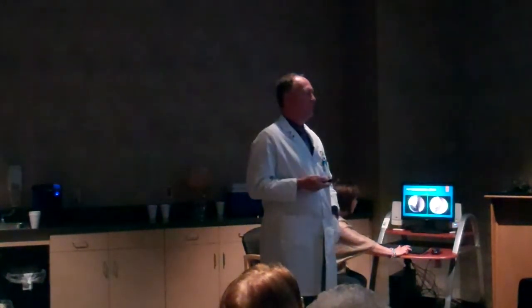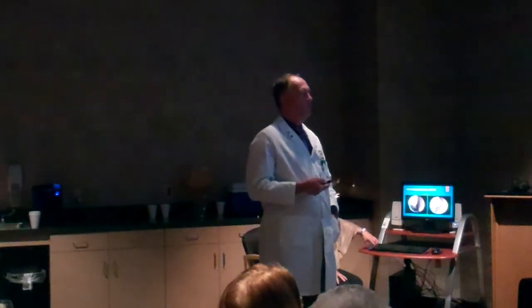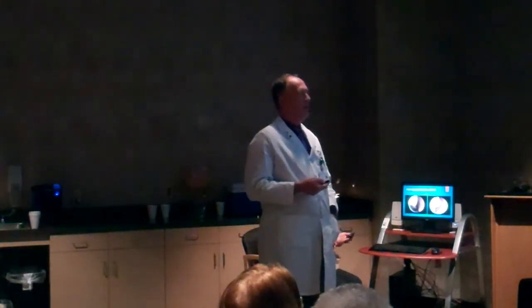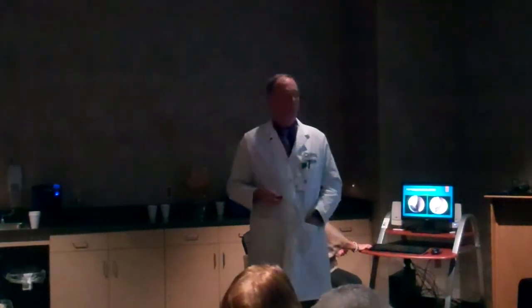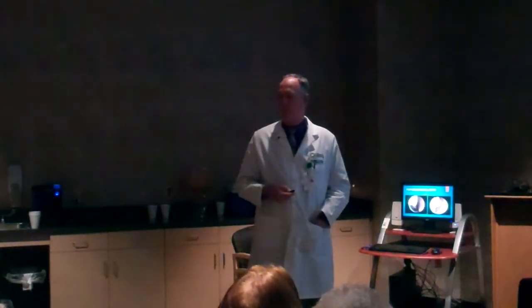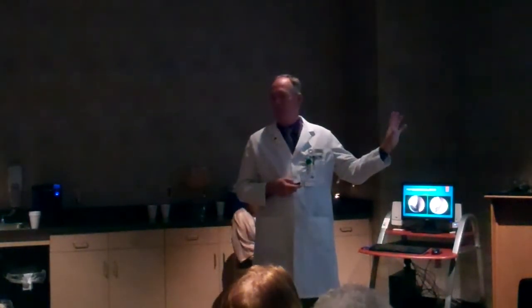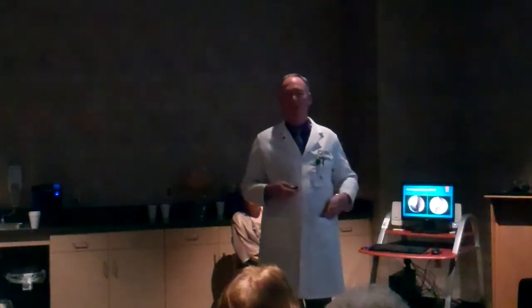Go back down. So this turbinate is normal size, and you've got plenty of air around there. There's a nasal cycle where this turbinate swells up and the other turbinate is small, and so it does most of the work of warming and humidifying the air, and then about 6 hours later it changes over.